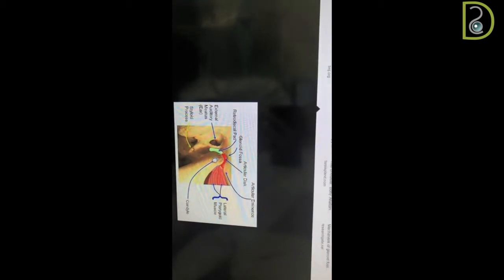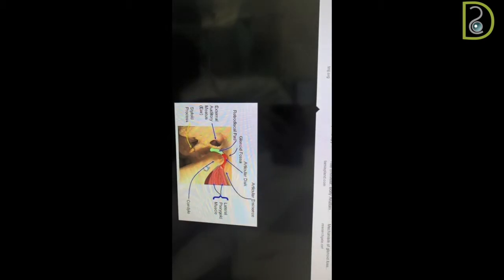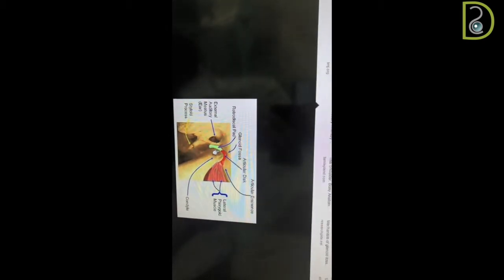So as the condyle is being stretched from the fossa, at this position there is too much force, tension, a pull on the head of the condyle from the muscles that are attached to the head of the condyle. So there is an acceleration of the growth of the mandible.